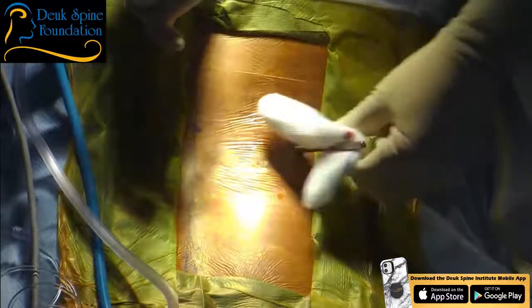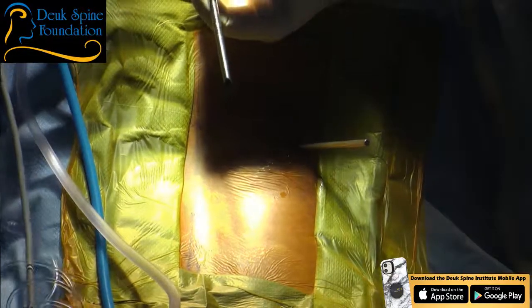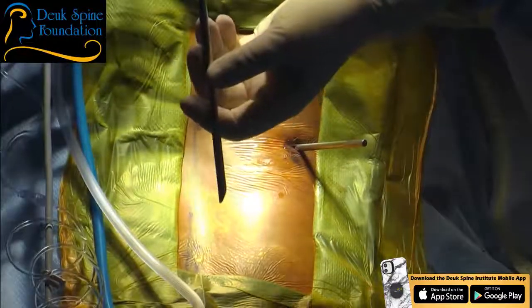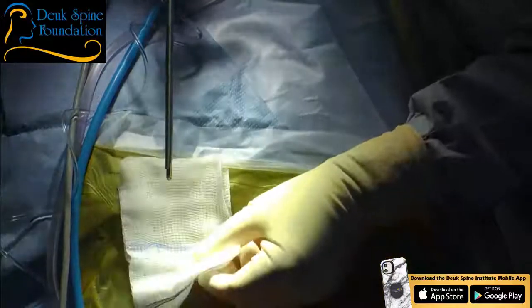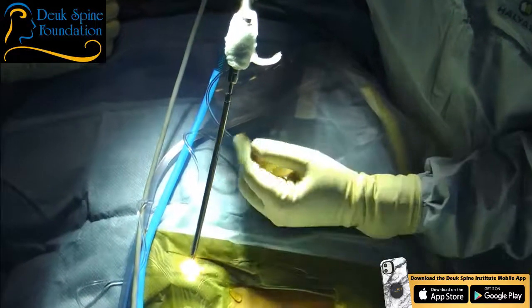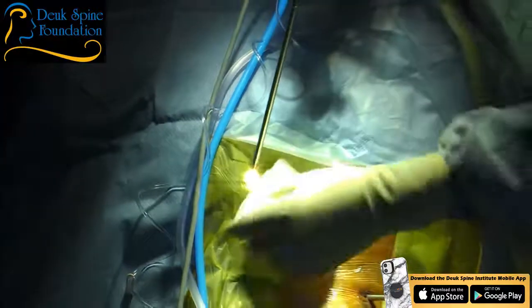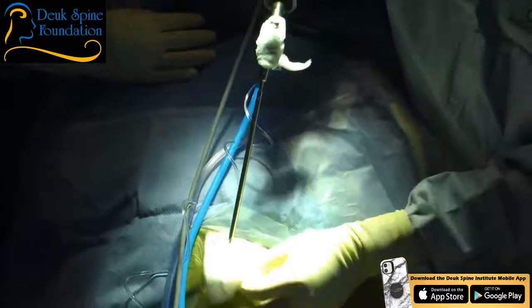Dr. Duke demonstrates the endoscope's light output for viewers — showing how well-lit it is. He clarifies the optical system uses a rod lens system rather than fiber optics, though the light delivery and the cervical scope version do use fiber optics. He then turns the scope off briefly while bringing the tubular retractor into position, reiterating that this is a true surgical endoscopic procedure, not a percutaneous needle-based technique despite using a needle at the start.